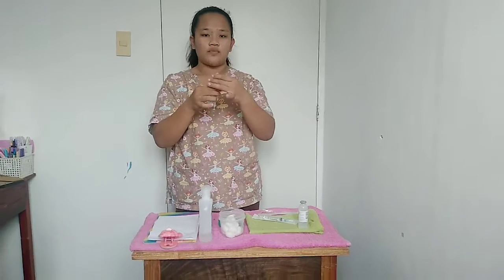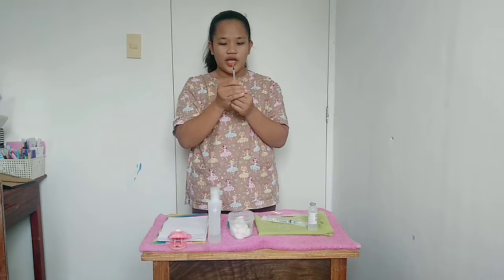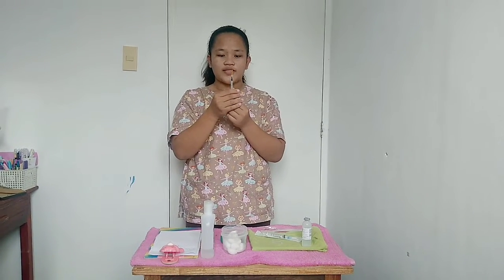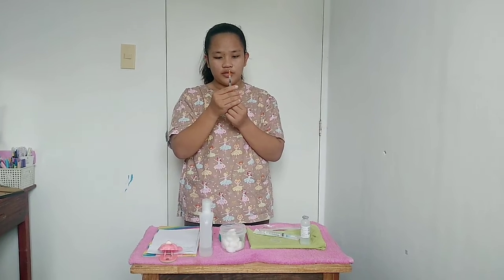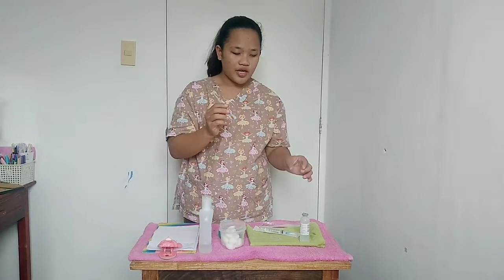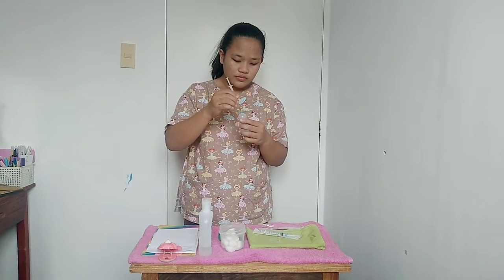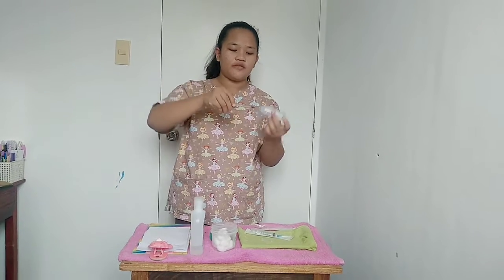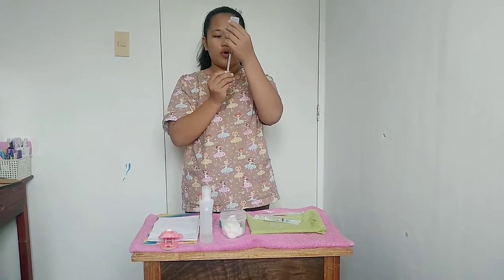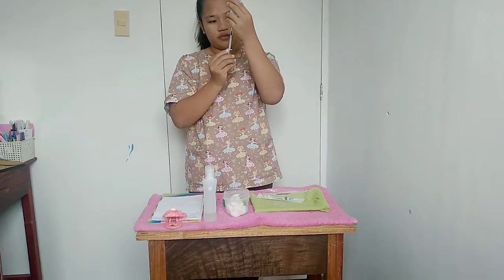We are going to uncap the syringe and draw air into the syringe with the exact amount of the medication needed, and then insert the air into the vial. Then invert the vial and withdraw the medication that is needed.